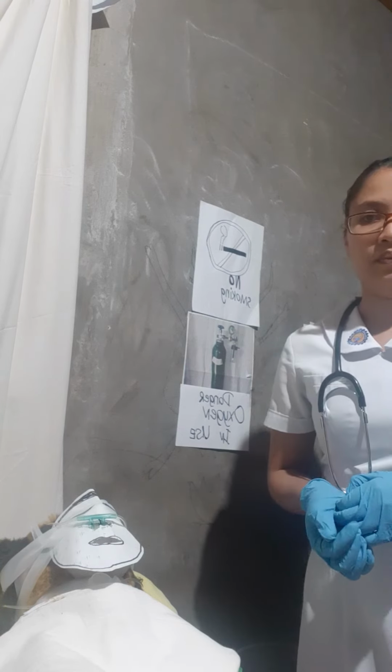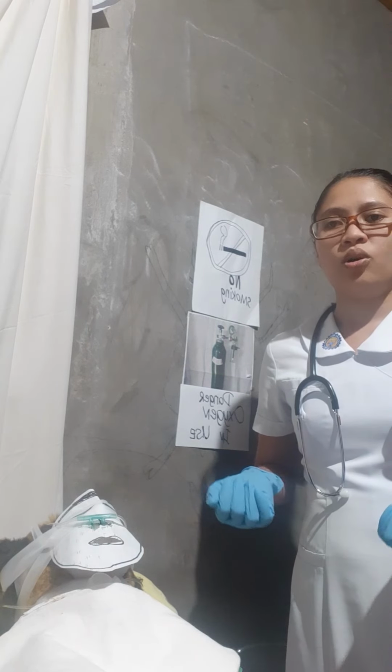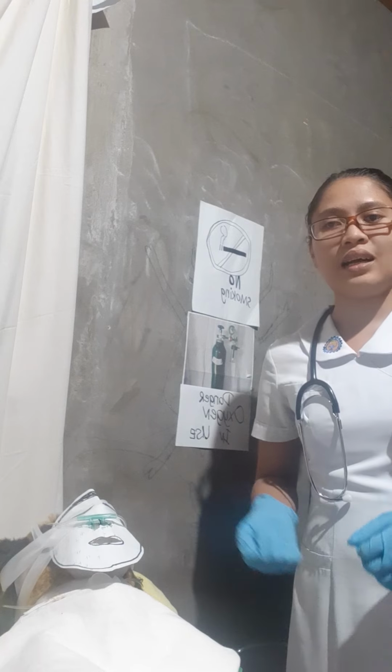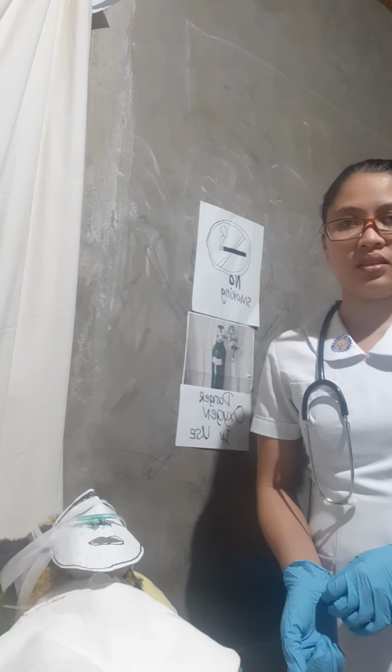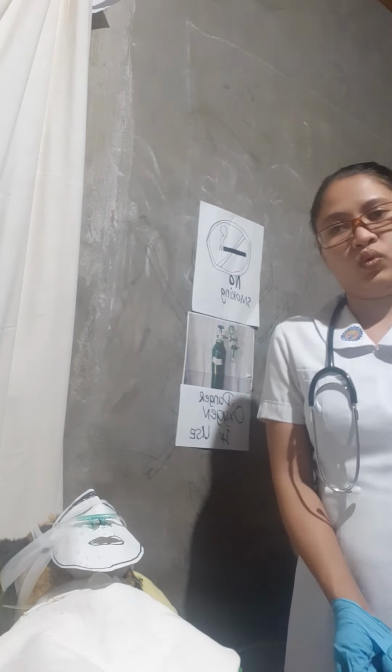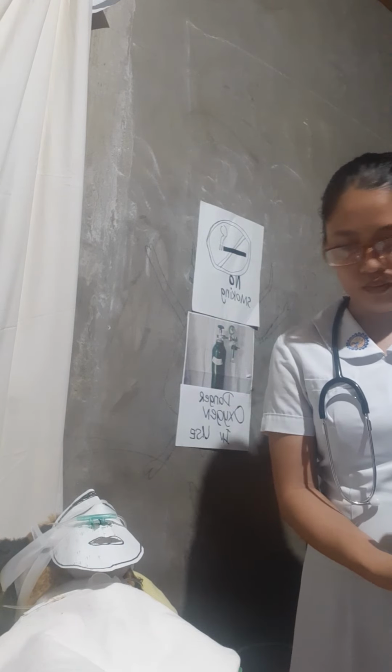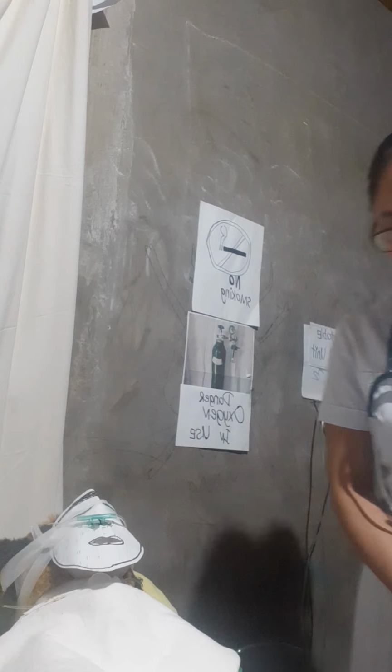Afterwards, we need to put on a face shield or goggles or mask to protect us from the secretions also, and put on sterile gloves.